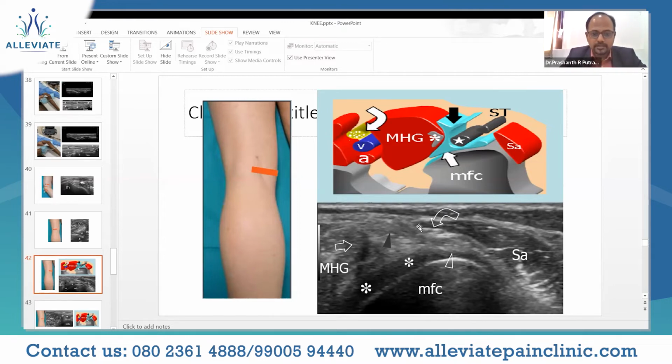One more important structure in this slide would be the relationship between sartorius and the saphenous nerve. We also know that in the anterior thigh, in the knee, we do give the saphenous nerve block over there, right? So this is the sartorius muscle belly, and at this level, just beneath the area between the medial femoral condyle and the sartorius, we would appreciate a hyperechoic mixed intensity structure that would be the saphenous nerve at this level, at the midpoint of the popliteal fossa, medially. All right.